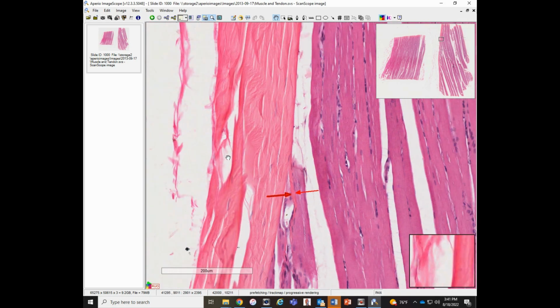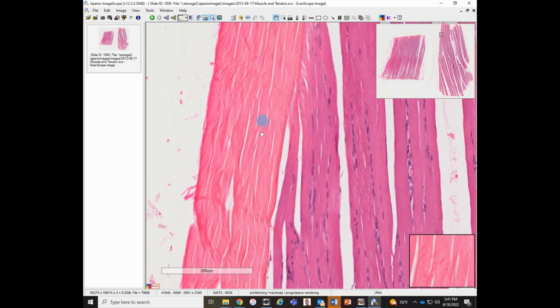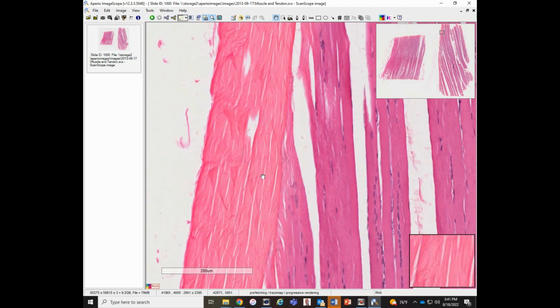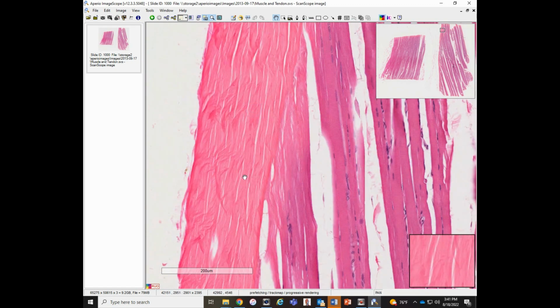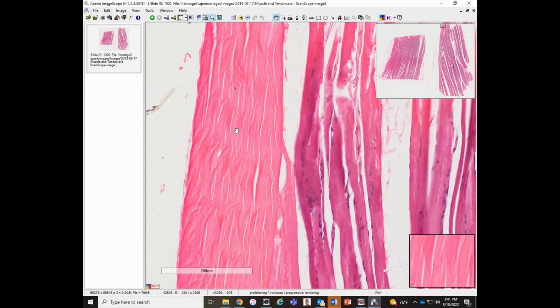And this is just going to keep collecting the connective tissue of this muscle as we get further and further away from its central area, and the muscle goes away, leaving only this dense, regular connective tissue behind, which will attach to bone as a tendon.